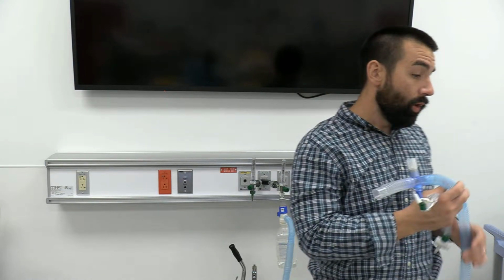So why would we provide bland aerosol therapy? It can be to condition the airways or provide more moisture for somebody with a lot of thick secretions. All right, it can also be used commonly for swelling. So you've got subglottic edema, you've got croup, you've just had some sort of surgery done in your upper airway, and we're trying to keep things nice and moistened up by depositing the sterile water mucus blanket on there.